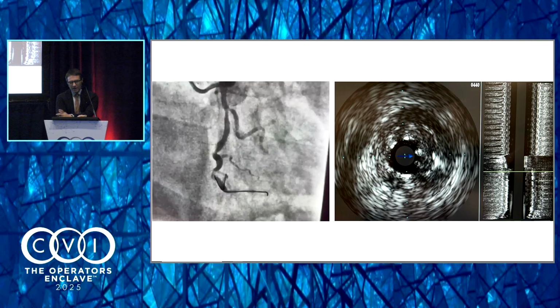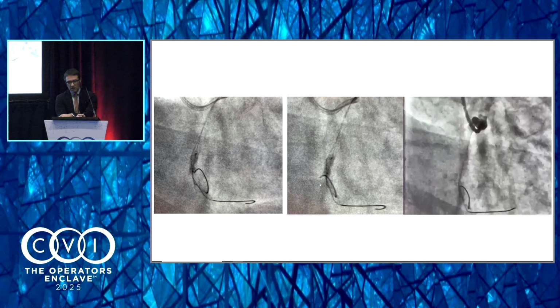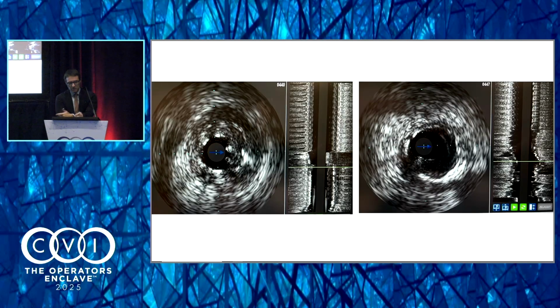But why do I show you that? Because the cutting wire technique was used in most of the cases. You can appreciate in this case that the wire positioned in the right position can push the stent struts easily against the wall and cut the plaque behind the stent struts easily, so you don't need to go up to 40, 45 atmospheres. In most of the cases, with 2 dilatations at 30 atmospheres with the buddy wire technique around, you can have a good angiographic result, and this is the pre and post cutting wire technique.